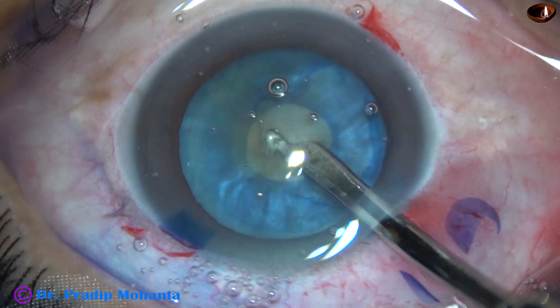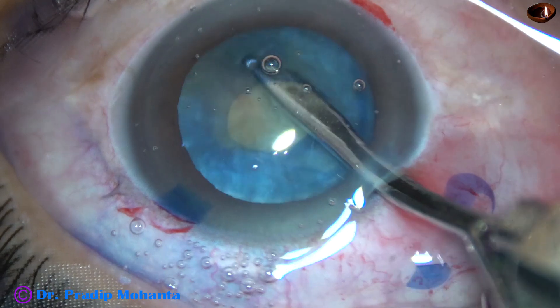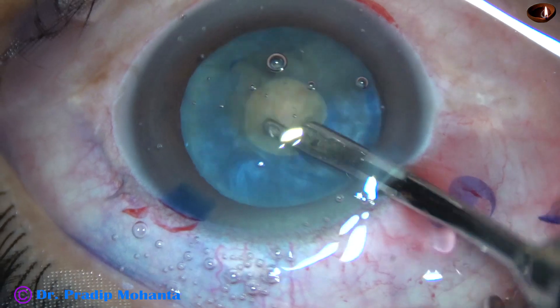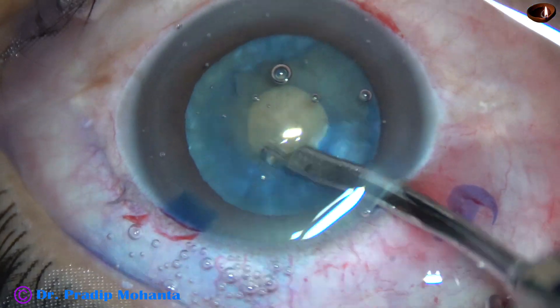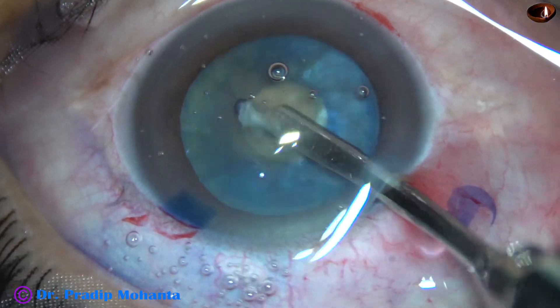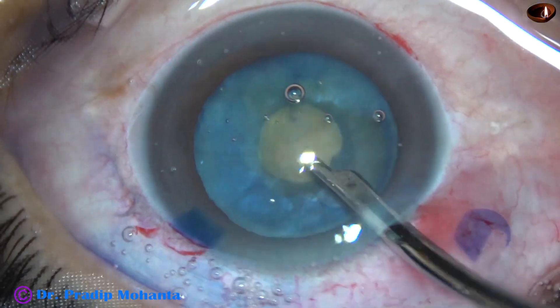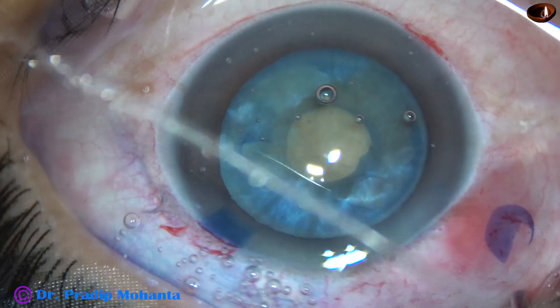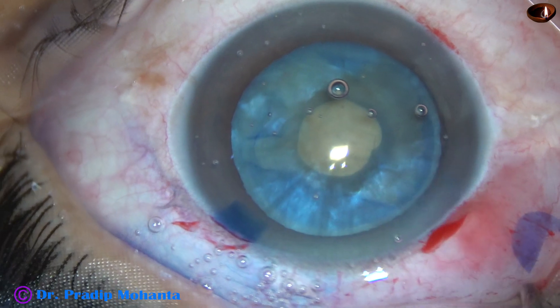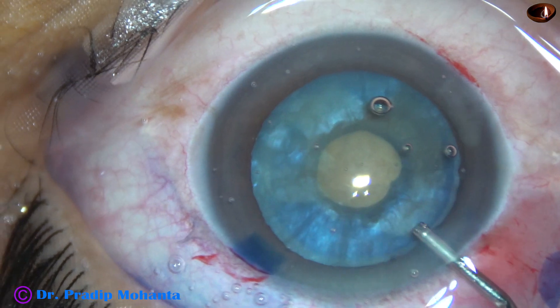As the nucleus is rotated, more cortical matter comes out. As soon as this cortical lens matter comes out from the capsular bag, the intralenticular pressure decreases drastically. Viscoelastic is again injected to fill the anterior chamber.